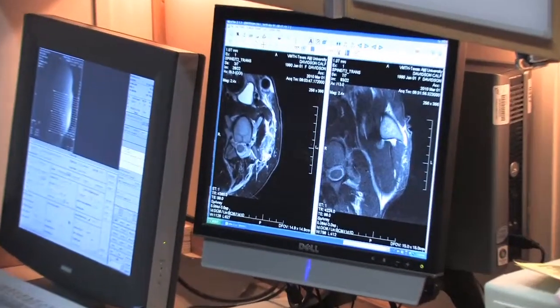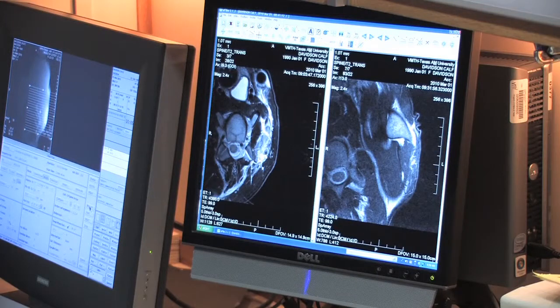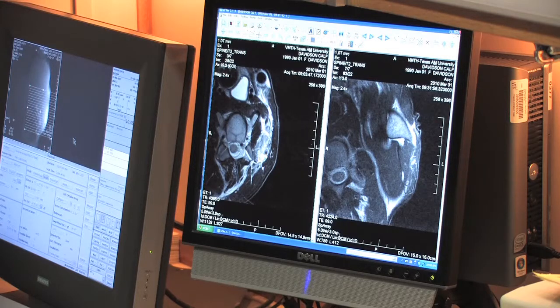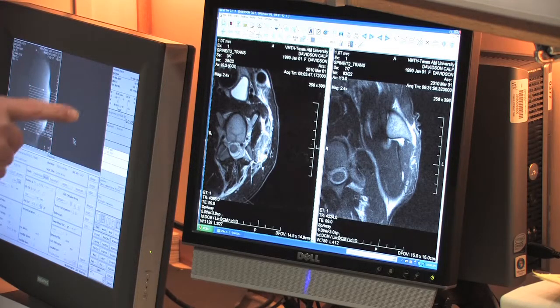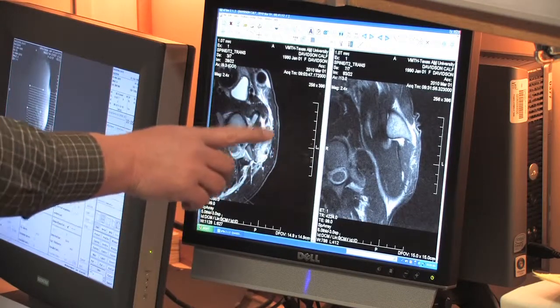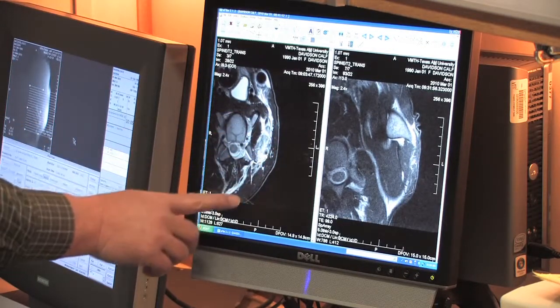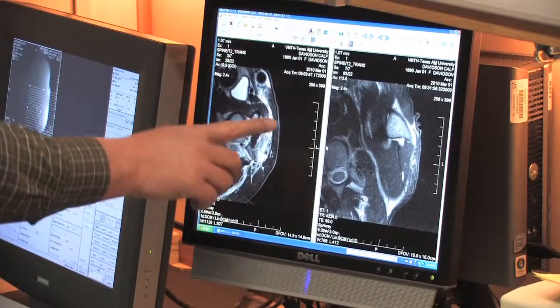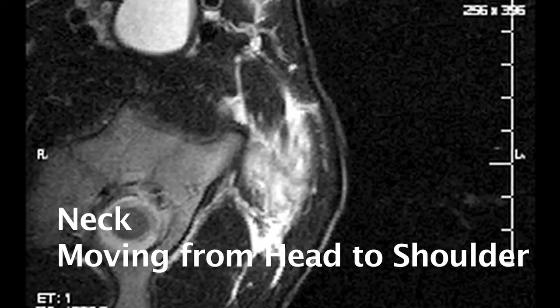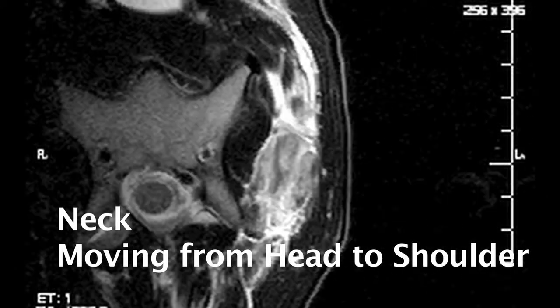This highlights the importance of following the labeled indications for a vaccine product such as the clostridial vaccine, where the labeled indication was actually for a subcutaneous injection. We wanted to illustrate what happens when it is given inappropriately, and here you can see very clearly this white-gray area — this is all normal muscle around it, and that's damaged muscle there, which would again result in trim loss of retail product.